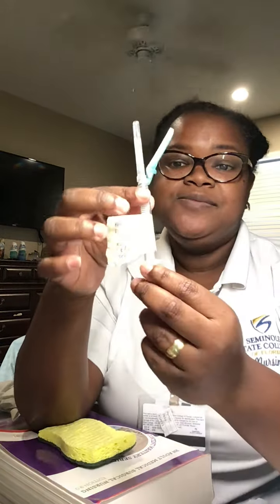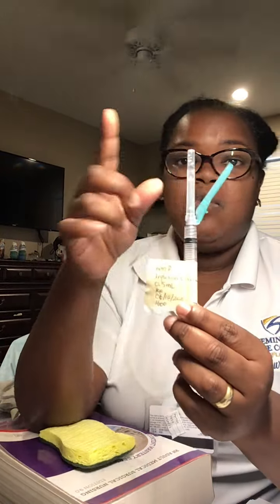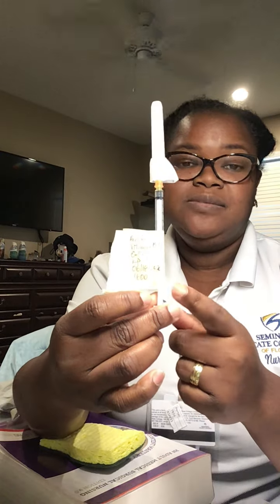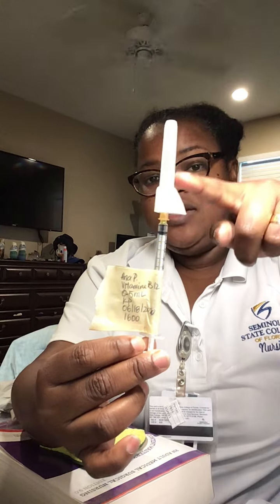Okay, I have everything. I did my first check and my calculations. I'm going to select my needles. For the intramuscular, I'm going to use a 3 ml syringe with a 22 gauge needle. For my SubQ, I'm going to use a 1 ml syringe with a 25 gauge needle.